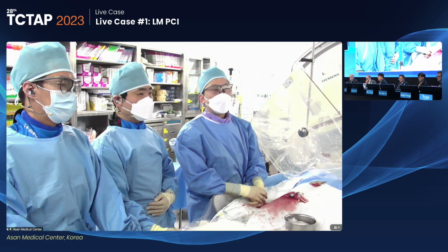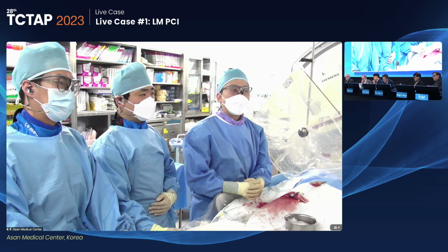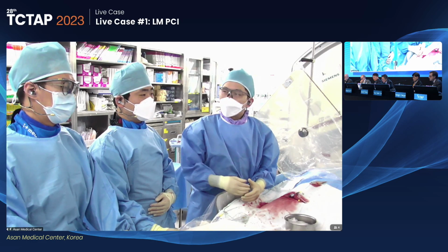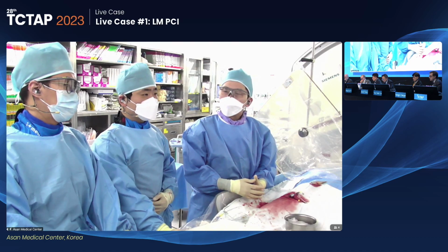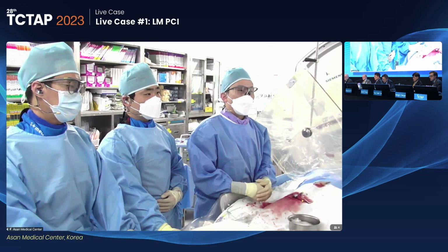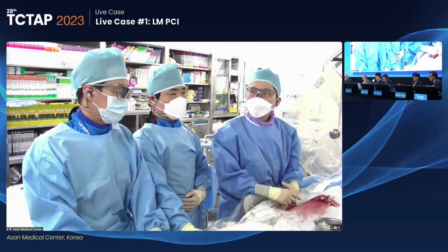Good morning. Would you introduce your case first? Yes, it is my honor to present the case in front of the masters of PCI. I will introduce my team. I am Dr. Do-Yoon Kang, a junior staff at Asan Medical Center. And he is Professor Sangwoo Park of Ulsan University Hospital, and Jin-Ho Lee, our senior fellow. We prepared a bifurcation case. Dr. Lee, can you please present the case?